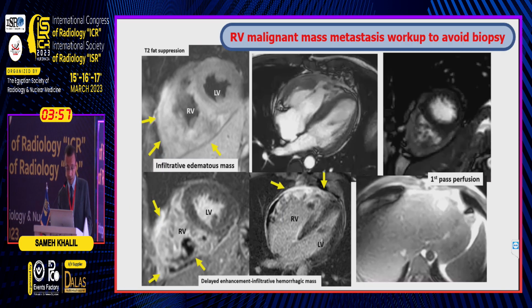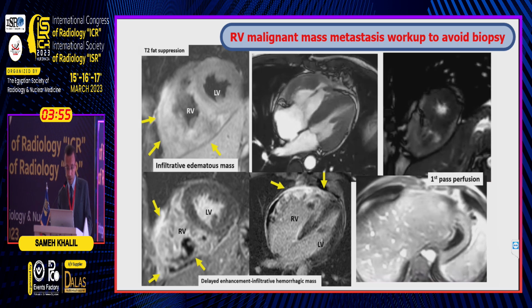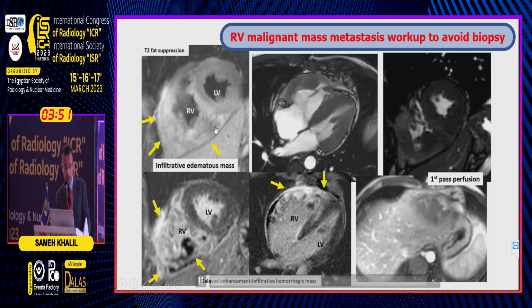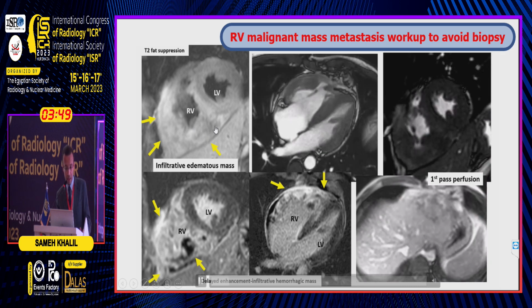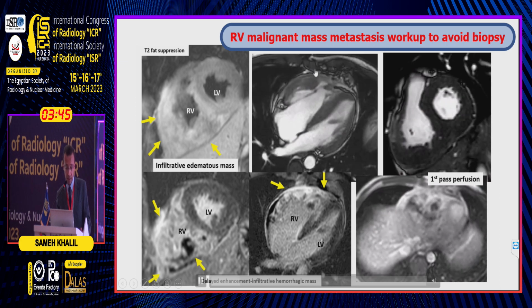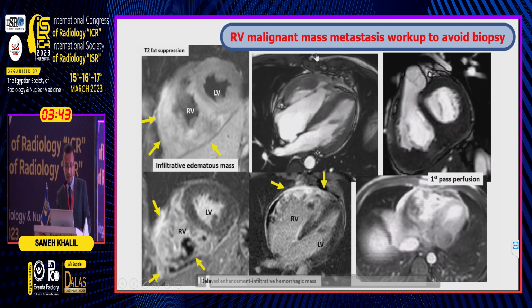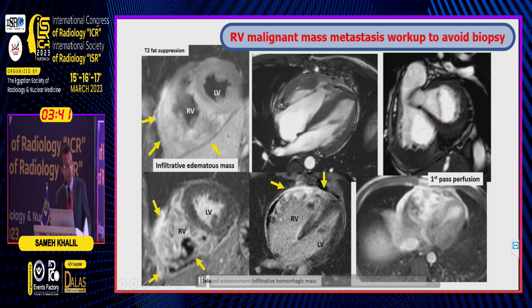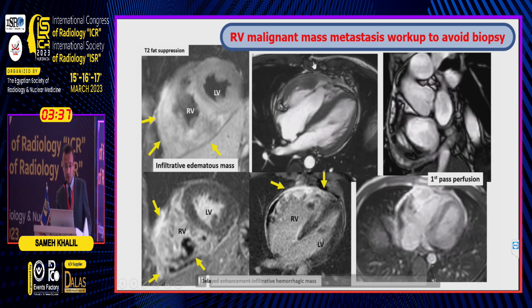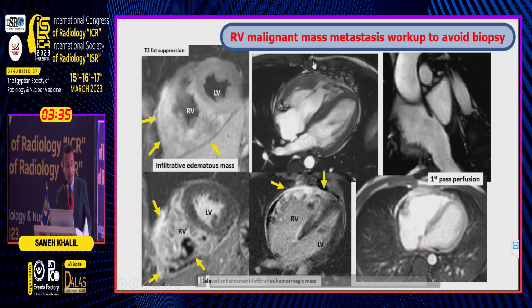As regards cardiac tumor, this was one of our patients referred to us, a 33-year-old with possible right ventricular enlargement. You know, the right ventricle is totally behind the sternum, so it is a dark area for the echographist, so it was referred to the cardiac MRI.